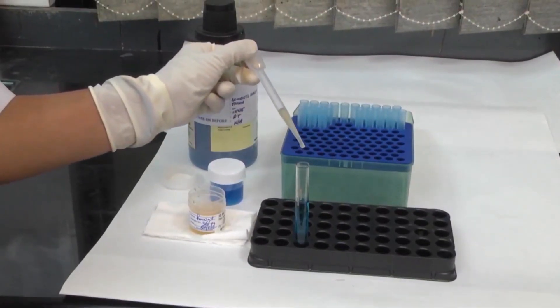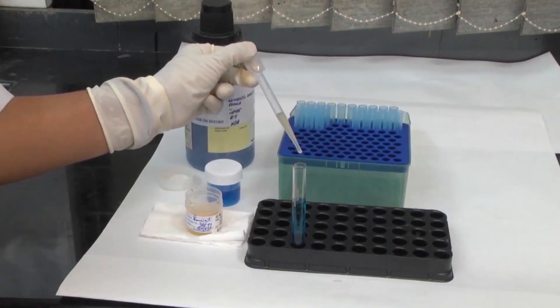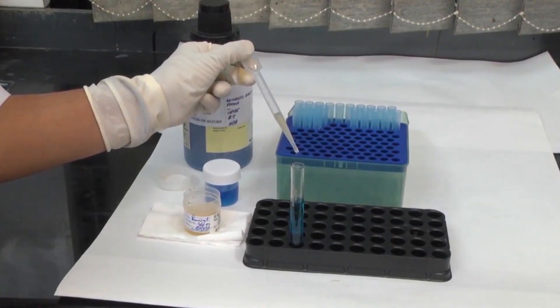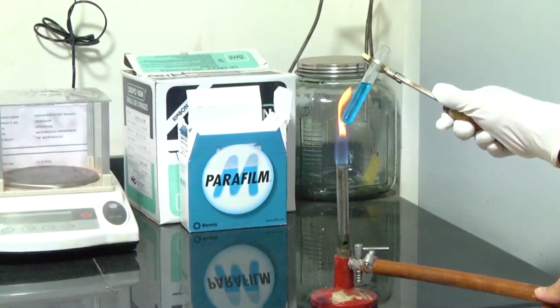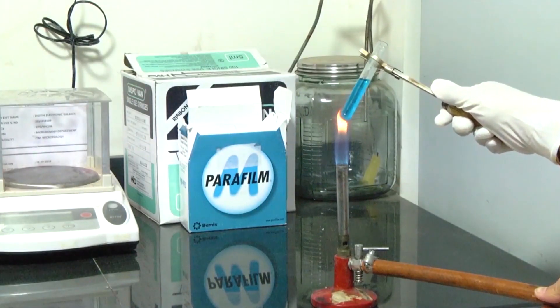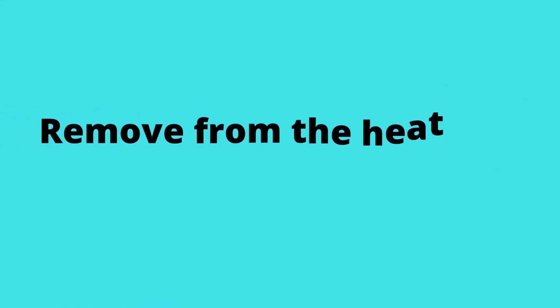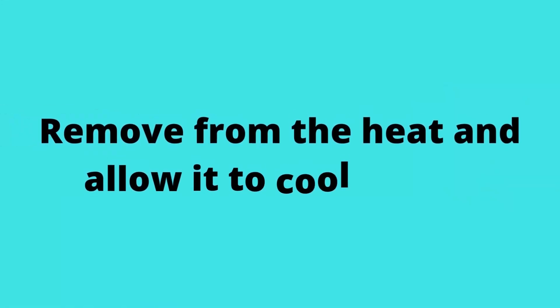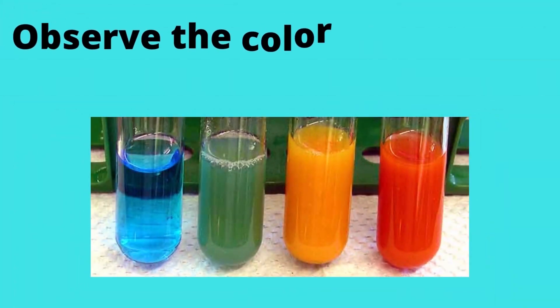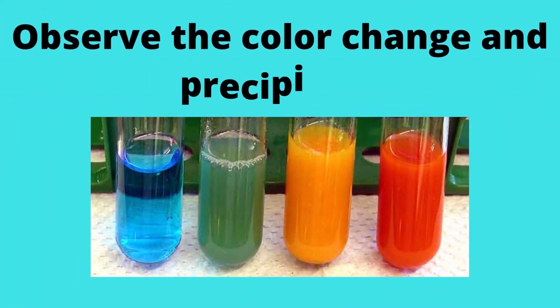Add 8 drops of urine into the tube, mix, and heat for 5 minutes. Remove from heat and allow it to cool slowly. Observe the color change and precipitate.